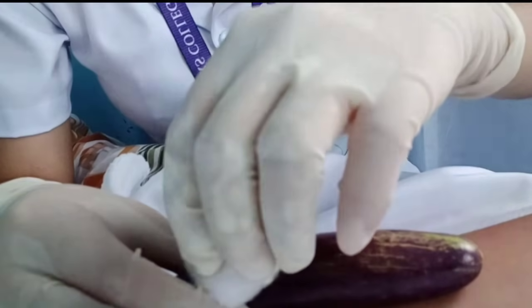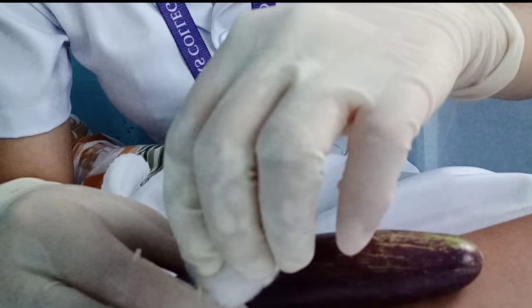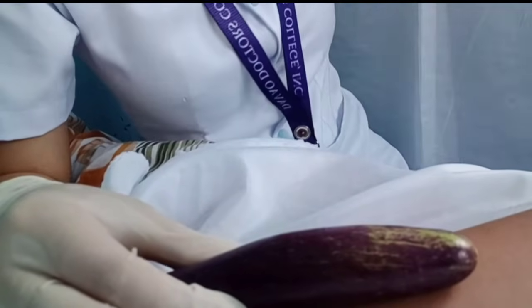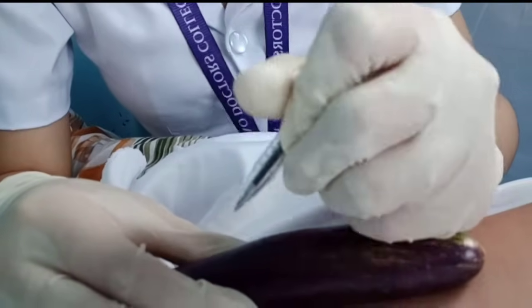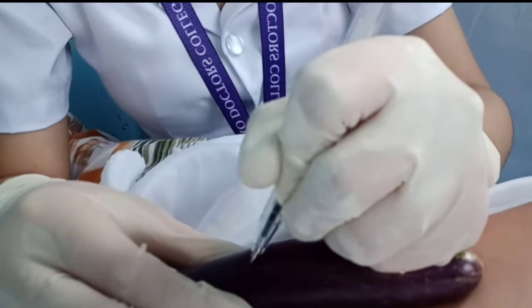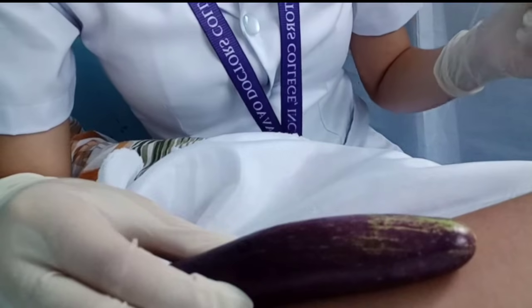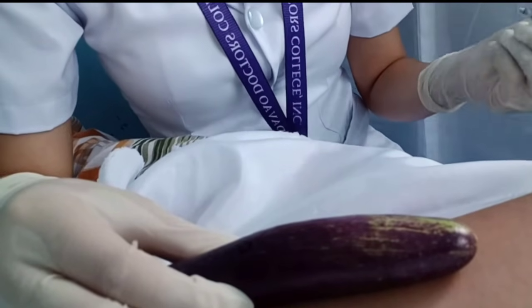Pat dry with a cotton ball and do not massage the area. Now encircle the bleb with a blue or black pen and instruct the patient not to rub the wheal or erase the mark. A red pen may influence the reading, and massaging the area may interfere with the test results by spreading the medication to the subcutaneous tissue.